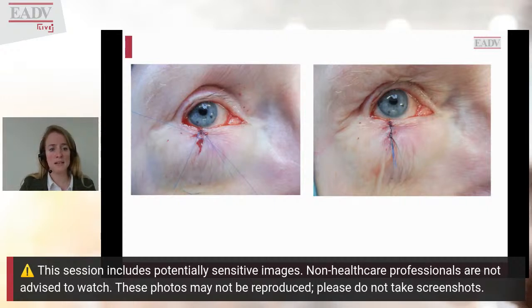After that, I put in my transcutaneous sutures, and for this I usually use a Prolene 6.0 suture. What you can see, as I've tried to make pictures of it, is that I try to knot every suture down with the next suture. I make one knot, and then I put in the previous suture, and then I tie over that my next knot, so that the sutures will not bother the patients during the week, and the suture, of course, isn't buried in the wound bed.